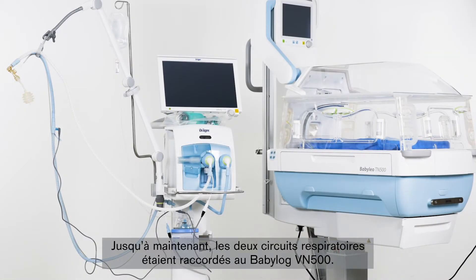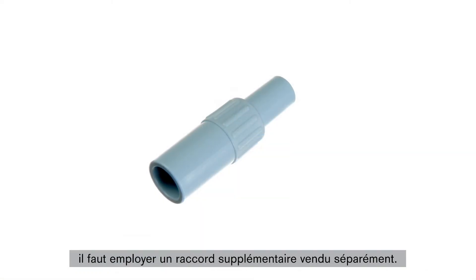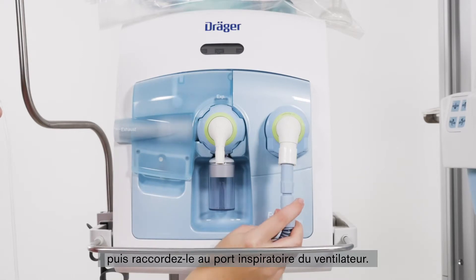Up until now, both breathing circuit systems were connected to the Babylog VN500. When using the VentStar dual and single-heated N-Plus breathing circuits together with a ventilator of the Evita family with Neo mode option, an additional connector is required, which is available separately. Connect this adapter to the inspiratory side of the hose and connect it to the inspiratory nozzle of the breathing device.